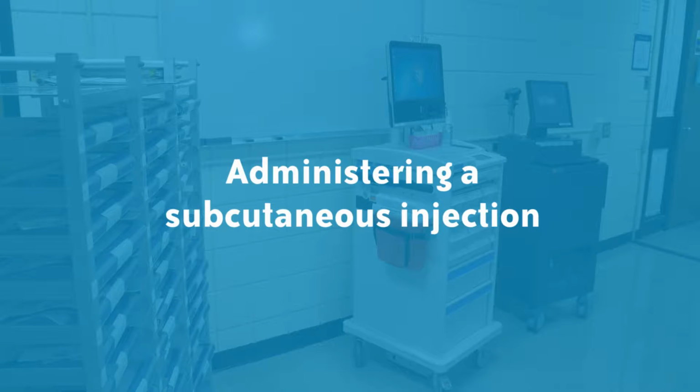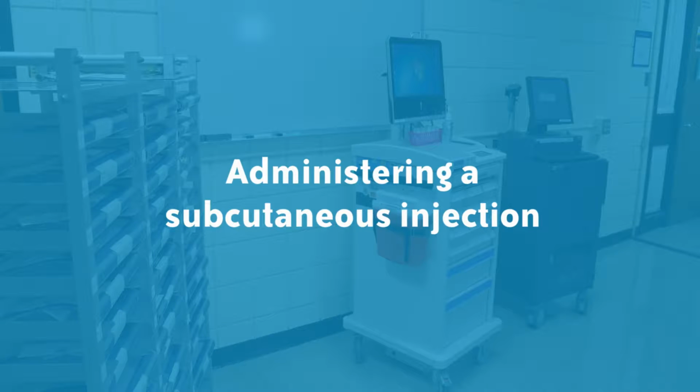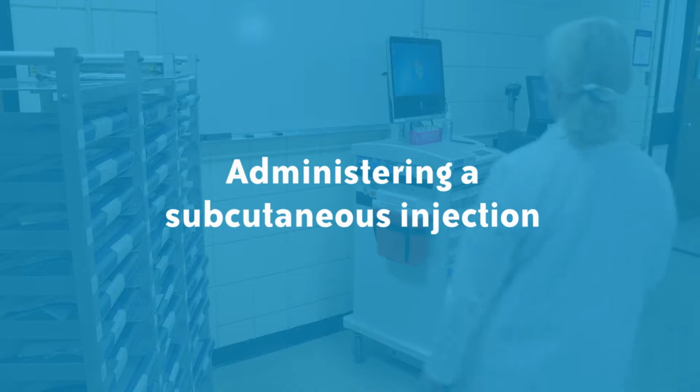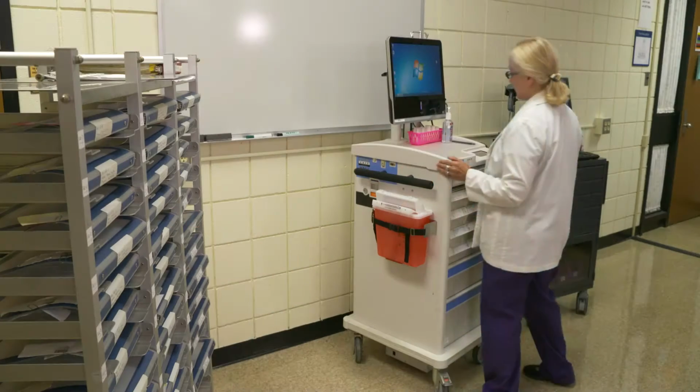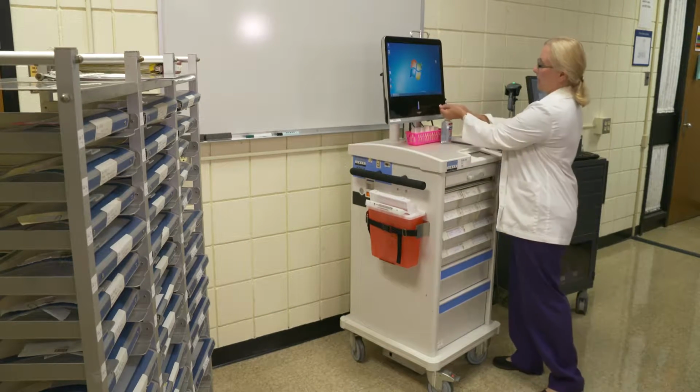This video will demonstrate the procedure for administering subcutaneous injection and an intramuscular injection. The nurse will be administering 0900 meds to Mike Tyson. The nurse will first complete hand hygiene.